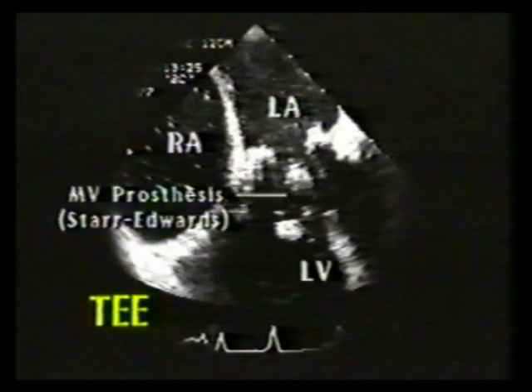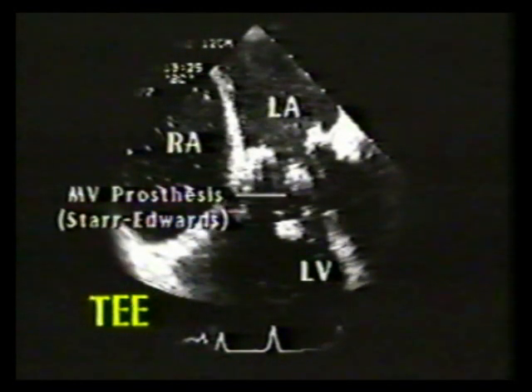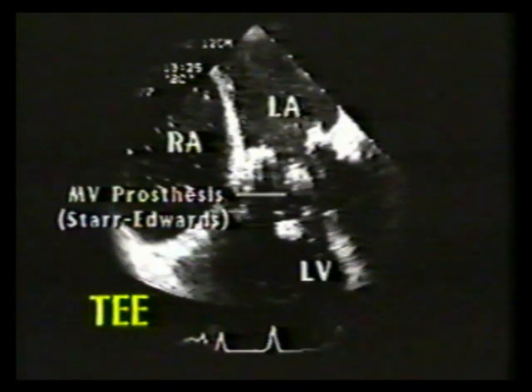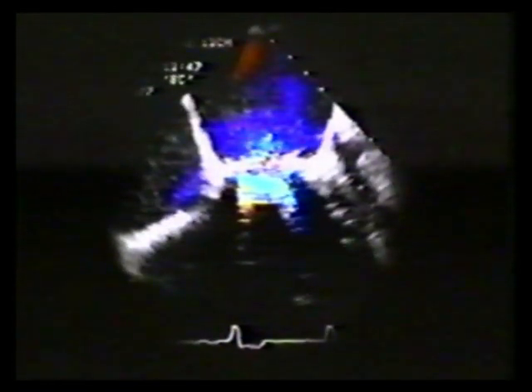The accurate assessment of the functional integrity of prosthetic heart valves is a clinical challenge that can be answered comprehensively with echocardiography. As with native valvular stenosis, the addition of Doppler has been a tremendous advance in delineating the hemodynamics of prosthetic valve function and dysfunction. The more recent application of flow imaging and transesophageal echo to the study of prostheses has been particularly useful for assessing prosthetic regurgitation. By using an approach which integrates all of these modalities, we can completely solve most diagnostic problems related to valvular prostheses.